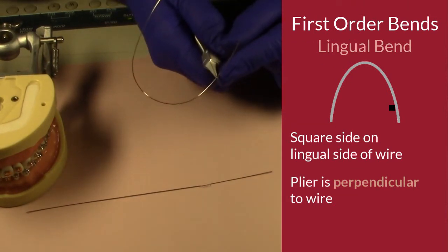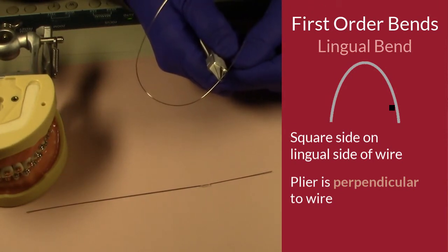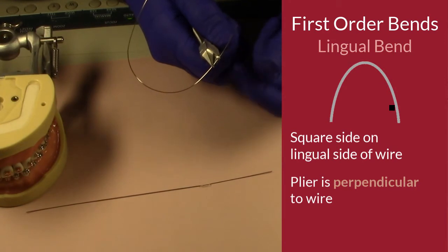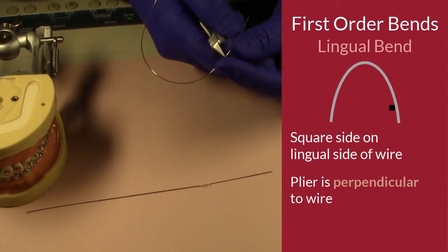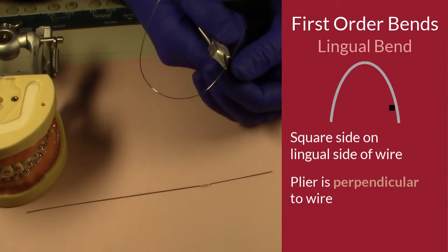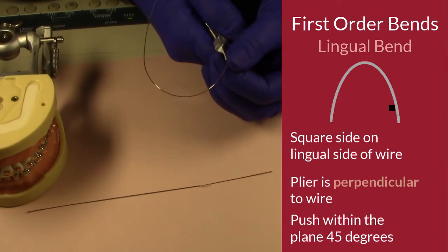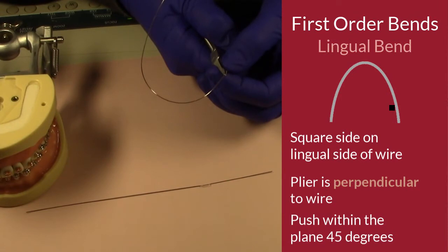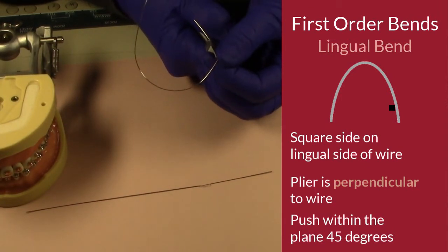So that's mesial to that dot, and I'm going to bend against the square part of the plier. I'm going to use my strongest digit, my thumb, because sometimes that wire can be very, very firm. I'm going to keep it within the same plane, but move it, again, 45 degrees, and keep it within that same plane of the arch wire. So I'm moving it lingually, right? And that looks like it's about 45 degrees.